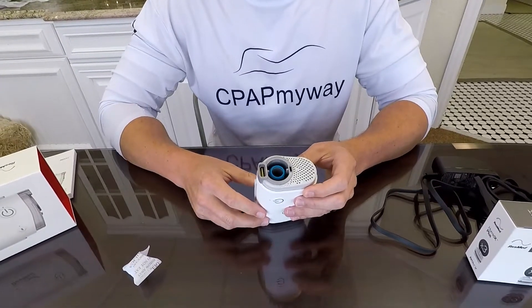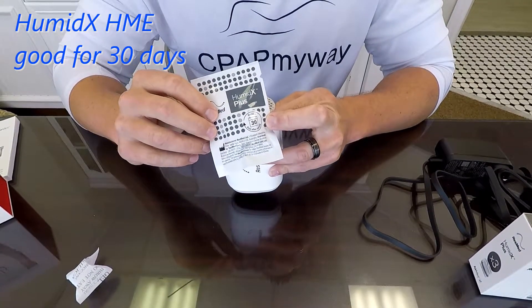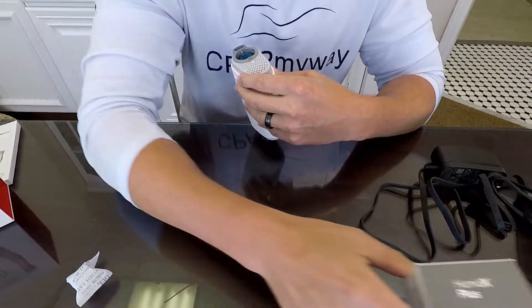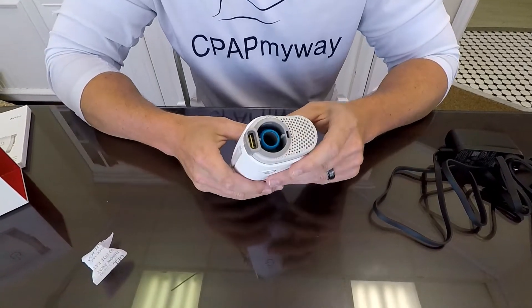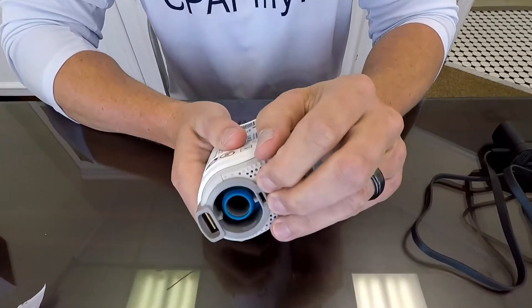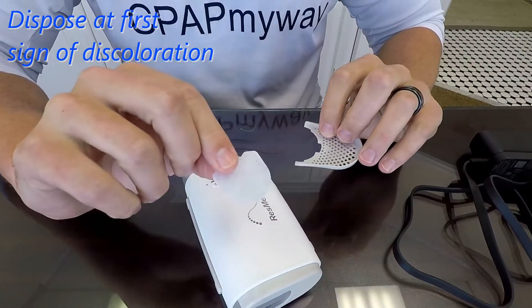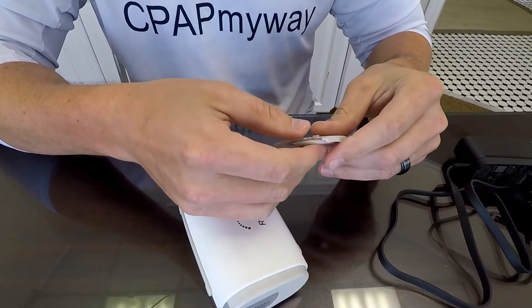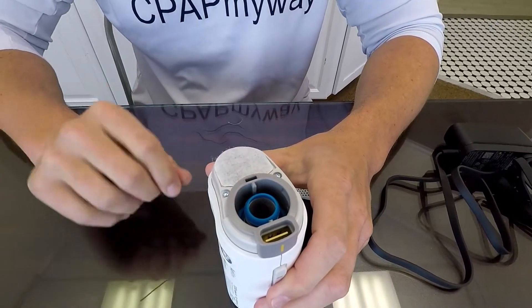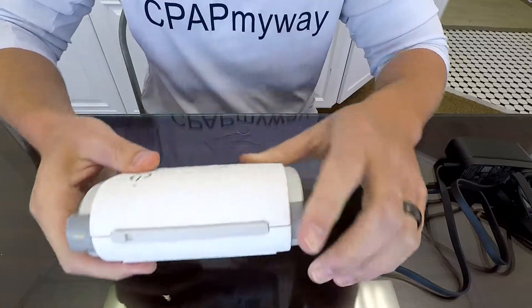As far as maintenance on the machine, you've got the HMEs, which are good for 30 days — you're supposed to dispose of it after 30 days and get a new one. They're available in a three pack or a six pack. Additionally, on the intake you'll notice all these little ported holes; there's a filter inside. Push down, pull it off, and on the inside you've got a little disposable filter. That filter needs to be thrown away after 30 days of use, or if you notice it's starting to get discolored. Then just slide your cover back on and it's ready to rock and roll.